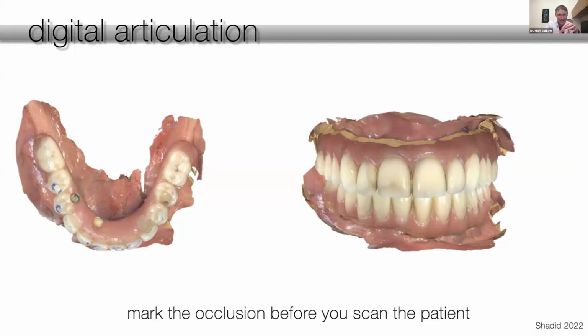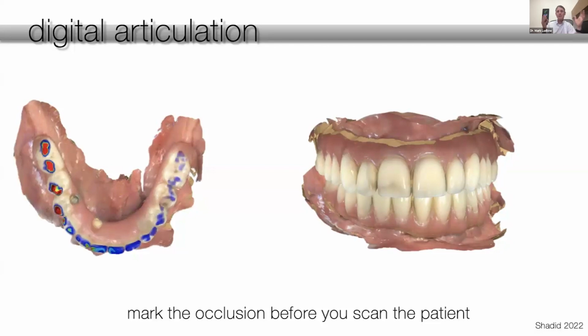And then when you digitally articulate things together by having the patient close, every scanner pretty much on the market will give you a heat map like this so that you can see where the teeth are coming together. And this is the great thing: if the marks line up with your heat map, you're good. Before the patient even leaves, you've verified the bite, okay?